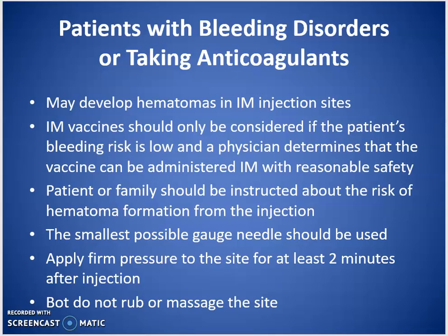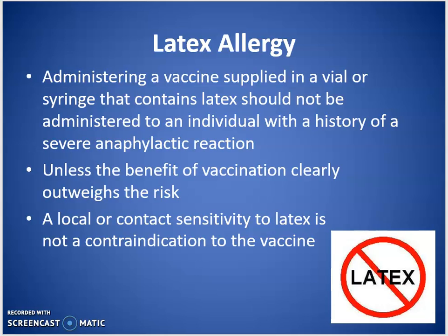Sometimes people will take an alcohol pad and wipe the injection site when they're done. Not recommended. It's going to cause a lot of stinging in that area, and it really doesn't serve much purpose. So you will see this in practice sometimes. If you're asked by a doctor or your supervisor to do this, or you're ordered to do it, then of course follow the order. But as a general rule, I wouldn't develop that habit. It usually doesn't really lead to anything.